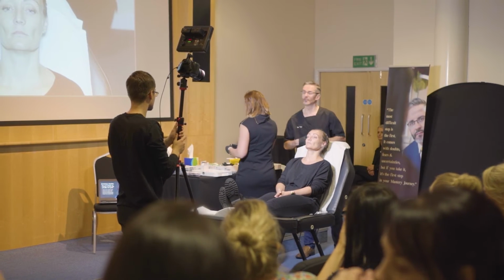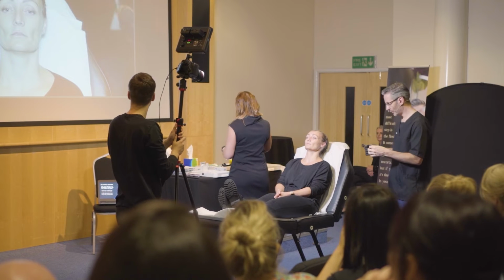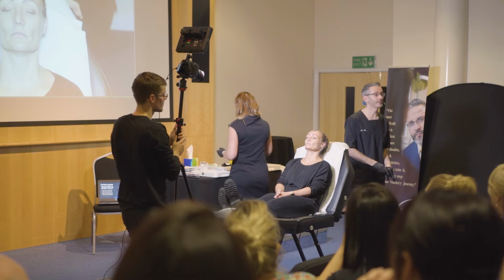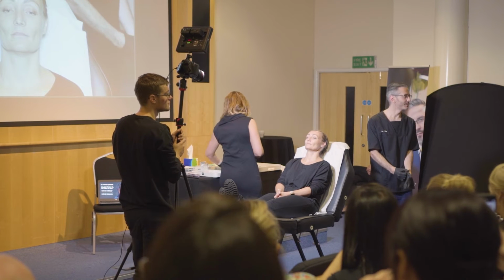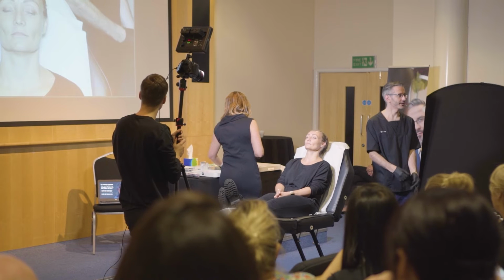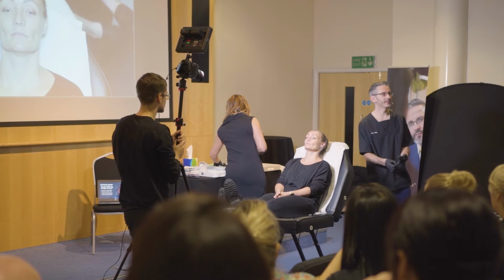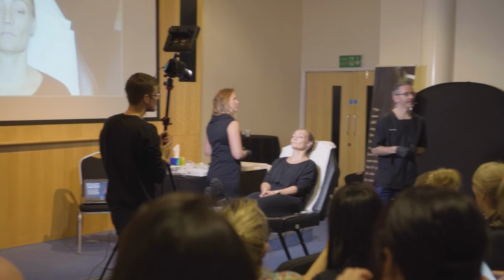Yes, please. So first injection is going to be the temple. And what are we worried about in the temple? It's the first thing you think when I say, would you like a temple injection? I can't hear anyone in particular. Lots of people have thoughts. Someone shout something. Blindness? How do you get blind from a temple injection? Which artery? Temple artery, yeah.